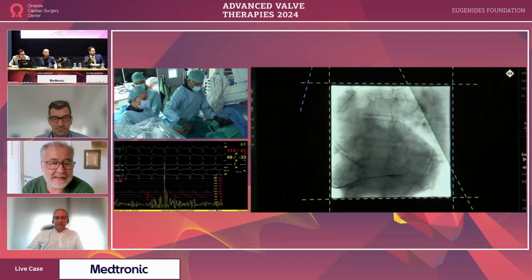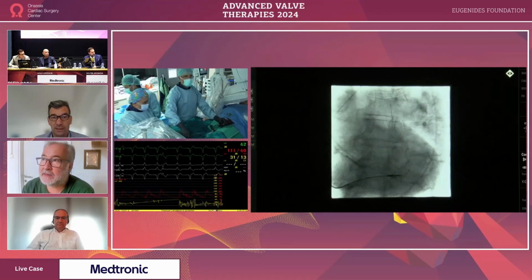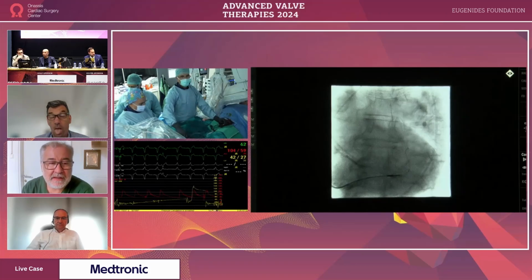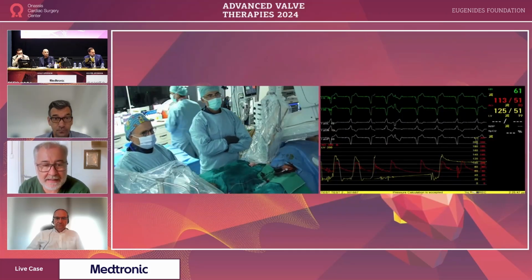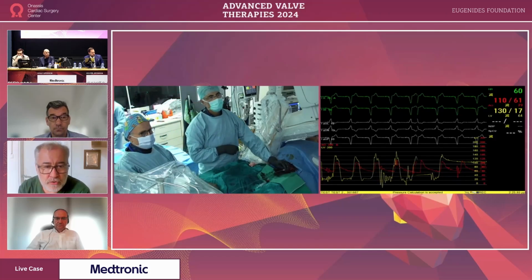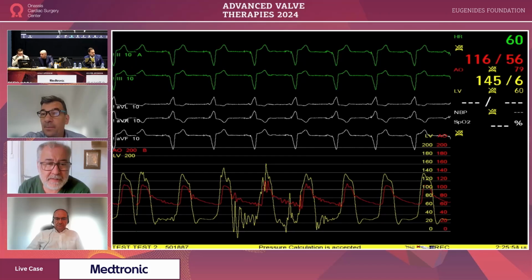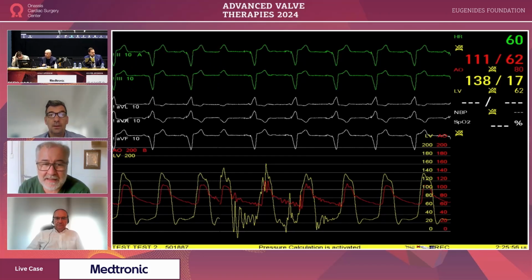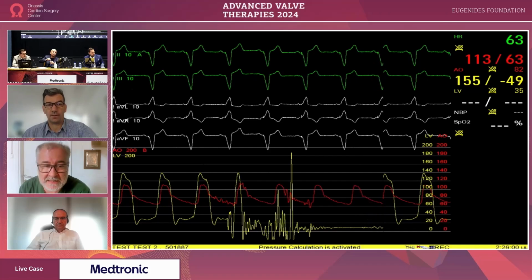Okay, I understand there is mounting preference, if not evidence, to use combined fluoroscopy with echo-guided puncture. The more you use it, the better you get. But I haven't changed my practice. Any time I've used fluoroscopy for arterial access. Venous access is another thing.